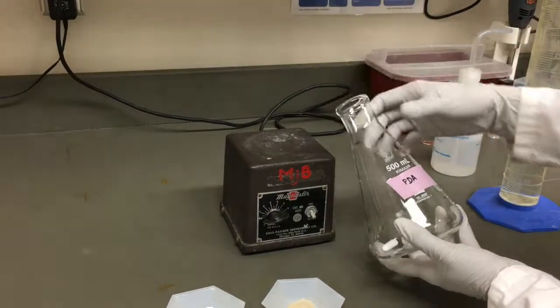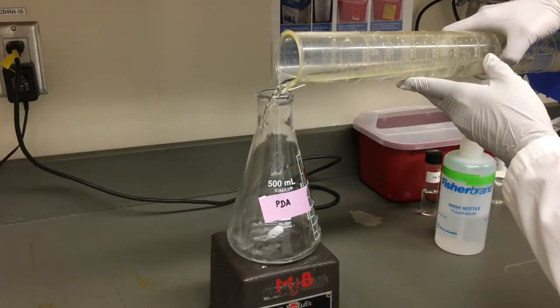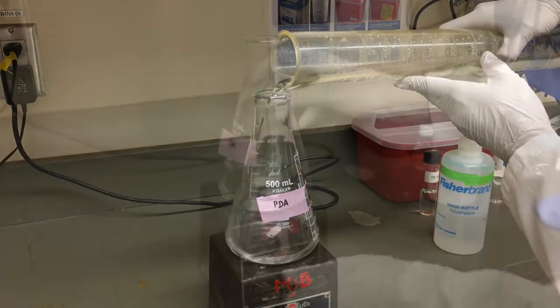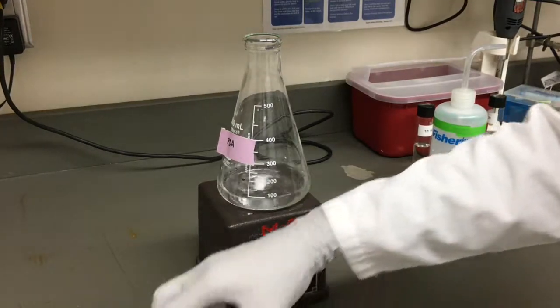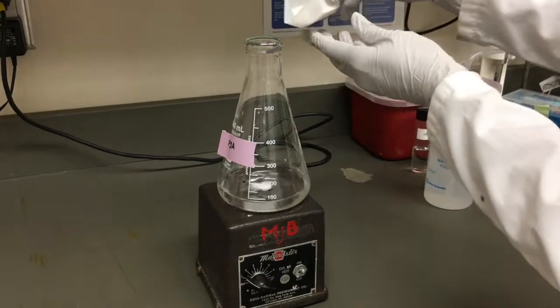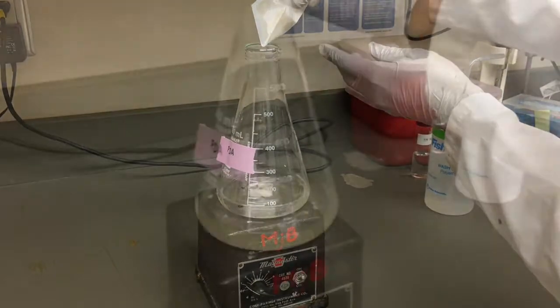Place a stir bar into your empty flask. Pour in about 50-80% of the final volume using distilled water and begin stirring. While stirring slowly, add the powdered media and allow it to dissolve.